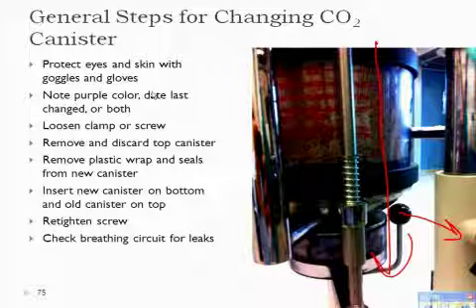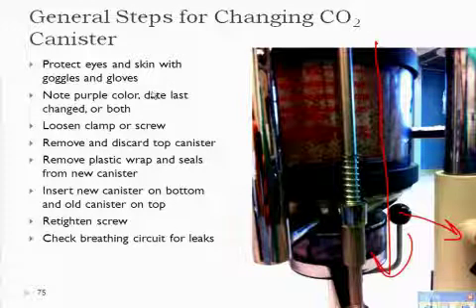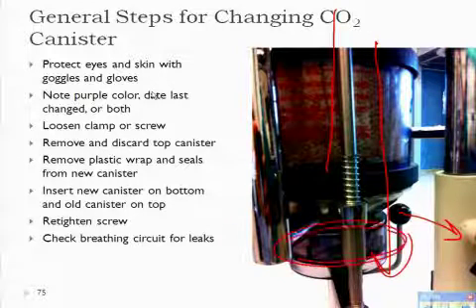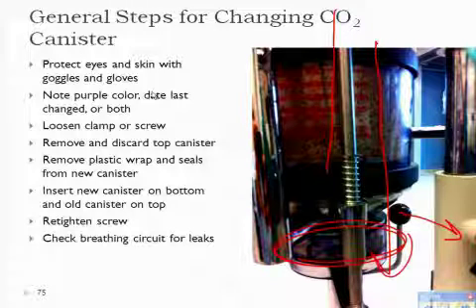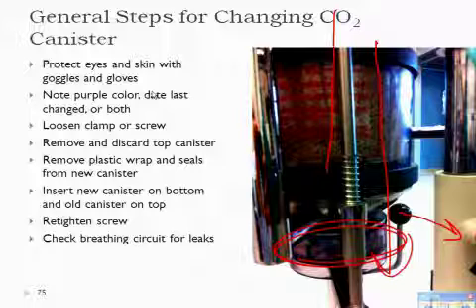Dust occurs. All right, this thing is wrapped in plastic whenever you first get it. When you rip that plastic open, you're going to see it's dusty. All right, this dust travels down, and it's caught in this dust trap right here. All right, this dust trap needs to be occasionally cleaned. Do we clean it? No. Anesthesia techs can clean it, but that's not something that we do.